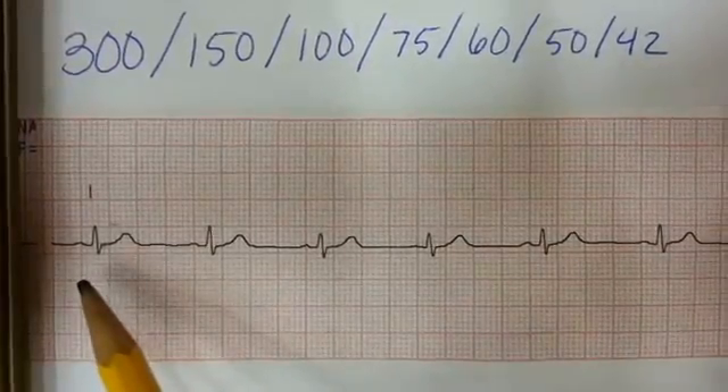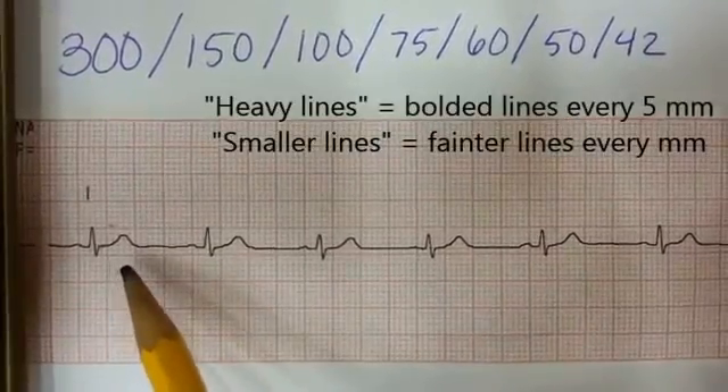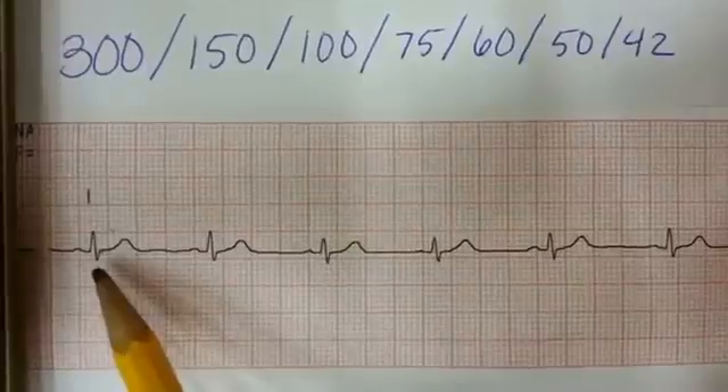You can notice that we have the heavy lines, then the shorter smaller lines, and another heavy line, then smaller lines again, and so on. We're going to take a look at where that QRS complex falls within the heavy lines.